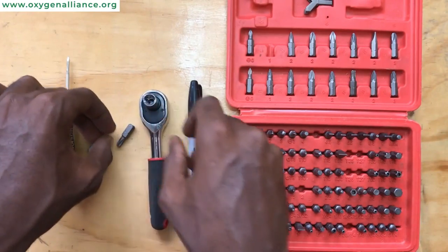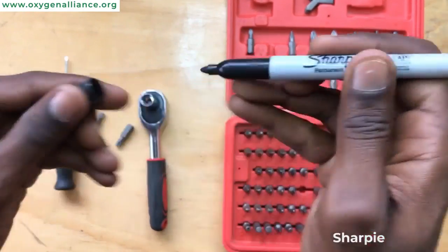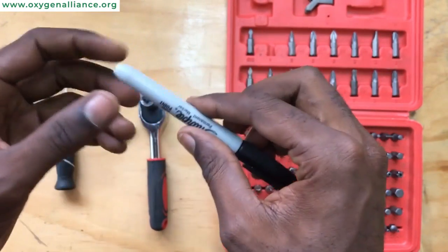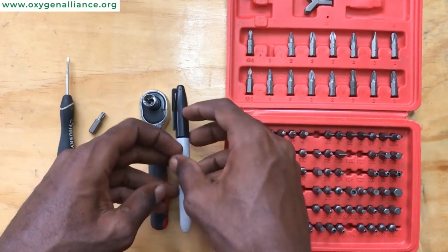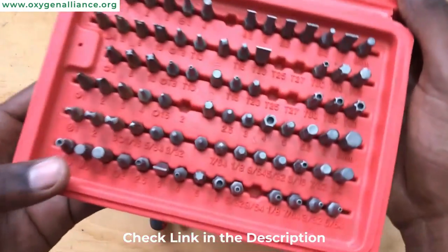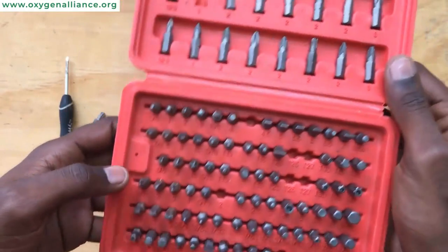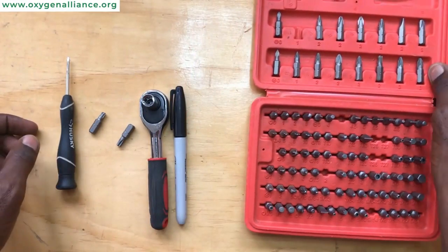We also have the sharpie. We use the sharpie to mark the compressor so that when we remove the head we know which side was facing the front and which side was facing the back. I would recommend that you get this red toolbox because it has all the different types of tips that you need — the Torx, the Allen key, the Phillips, and the flat. Once you get this you will have everything that you need.